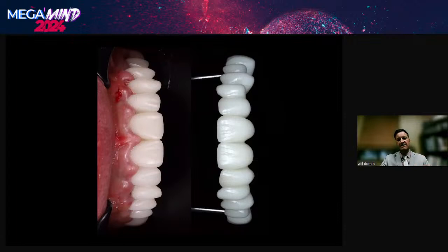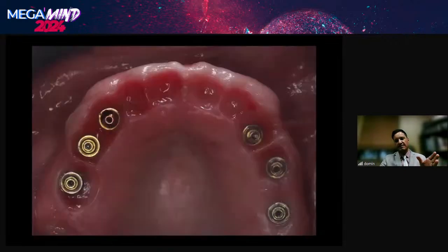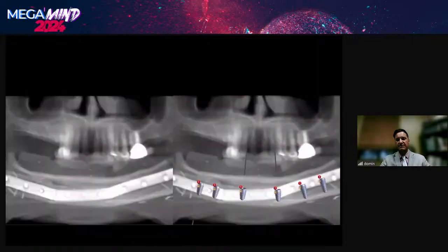Provisionals are key for cases like this because you can utilize the contours of the provisional prosthesis before you go to finals, and making sure that we have nice ovate pontic sites for FP1, but not all cases are FP1 or FP3. Thinking outside the box, there are cases where people are in much different situations.